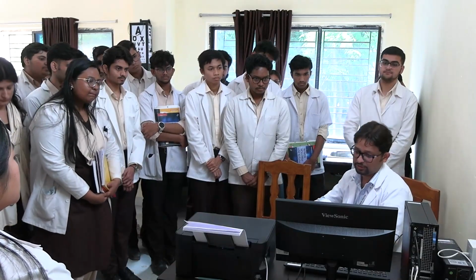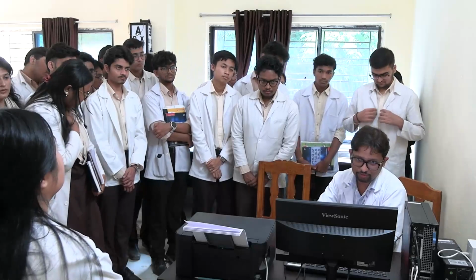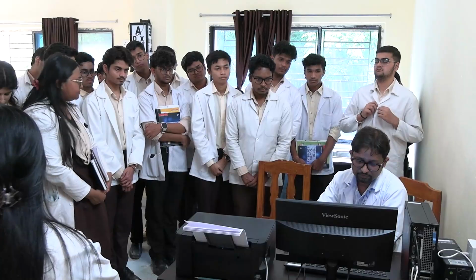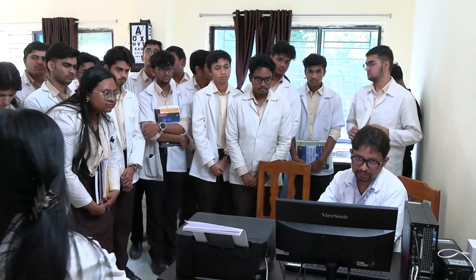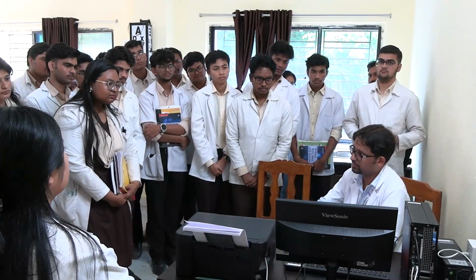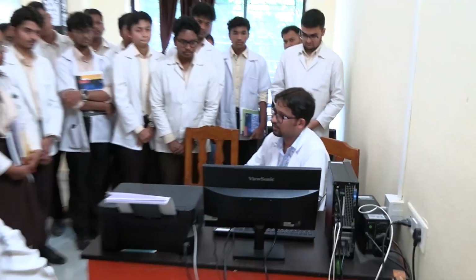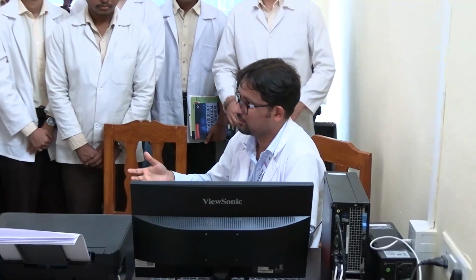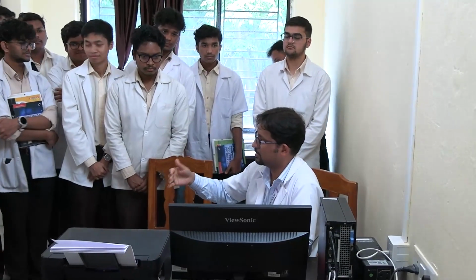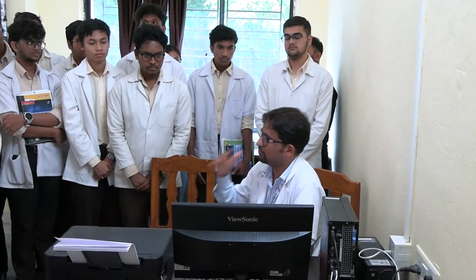Now what is there in the software? If you look at the interface of the software, this is what comes. Right? So first here you need to enter your anthropometric details. So vital capacity depends on a lot of factors: weight, height, age, right? All these things are there in the book also. You have all learned about this. These are factors on which vital capacity normally depends. If the age is less, vital capacity will be less.